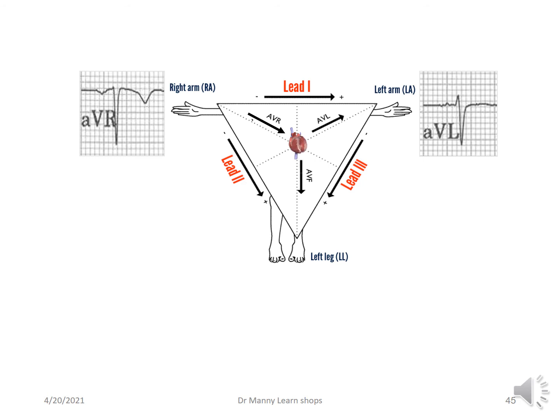The current, however, is going down towards this area, the foot, because that's where the left ventricle is really pointed to, left ventricular dominance. But again, it depends, as you'll see when we review a little bit later on in this session, where the electrical axis is going. But in the older person, or the adult, or what Eindhoven invented it for, they're left ventricular dominant. So therefore it will be going towards the left leg electrode, which means it will be primarily positive.